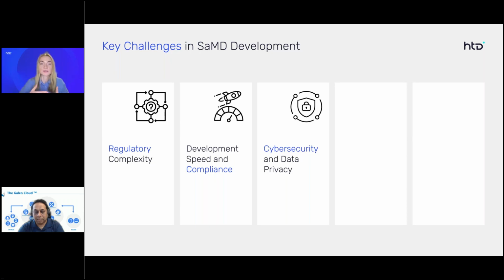We have to remember to keep an eye on that from the very beginning, because if we are developing software that is connected to the cloud, the security measures must be strong, because the data can be lost or accessed by somebody that shouldn't access it.